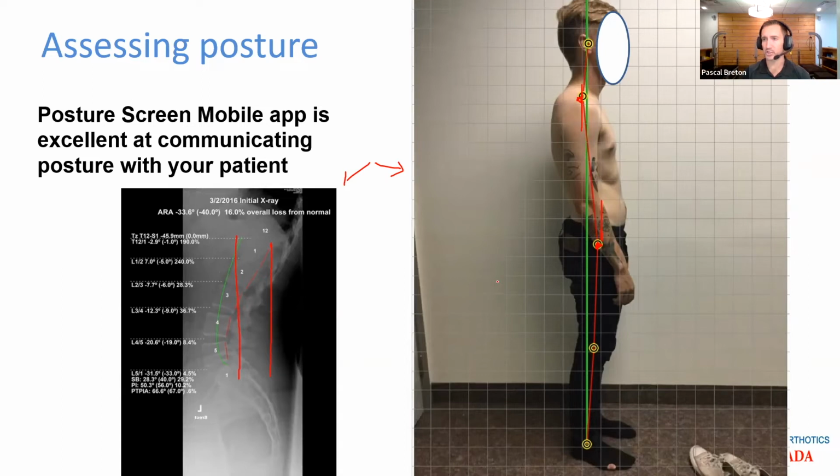That is a good patient to get a lumbar Denneroll, right? So here I look, right? I talked about less curve. This patient has got 33 degrees of curve. It's a reduced curve. Check. I have one indication. The sacral base angle here is measuring 28 degrees.